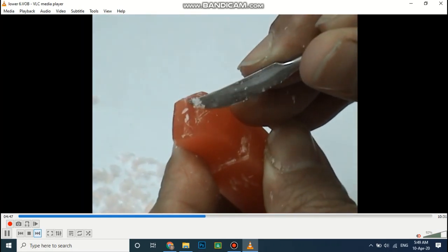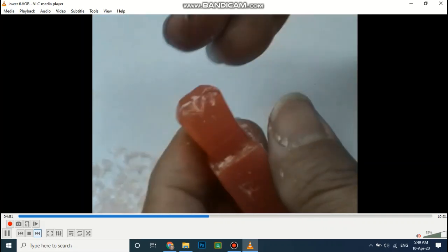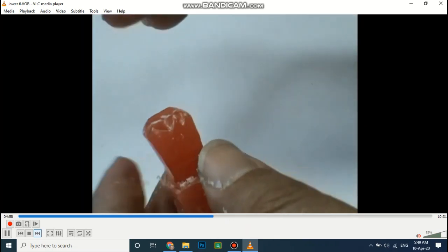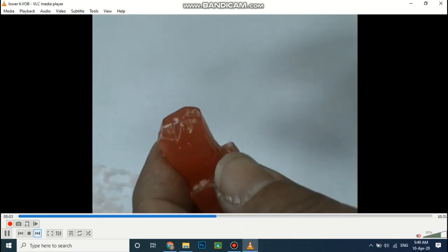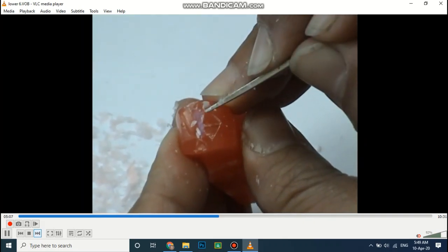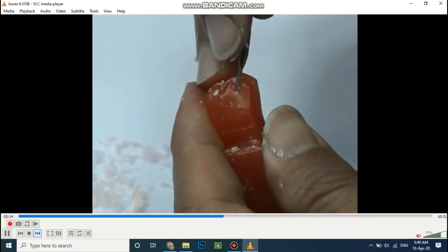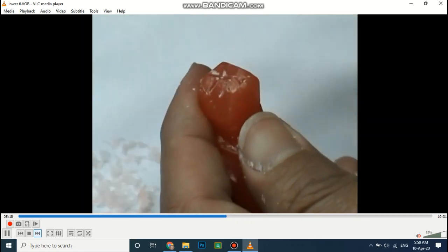Separation between distobuccal and mesiobuccal cusps is done now by creating a V-shaped notch between the mesiobuccal and distobuccal. To separate the distobuccal from the distal, half of the V shape is reduced from the cusp tip of each cusp, and the depth of the V shape is just 2 mm.